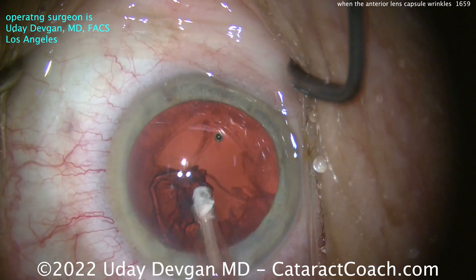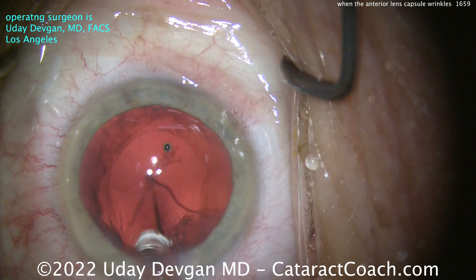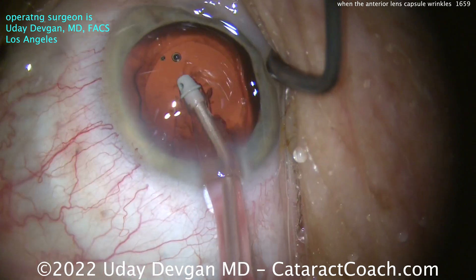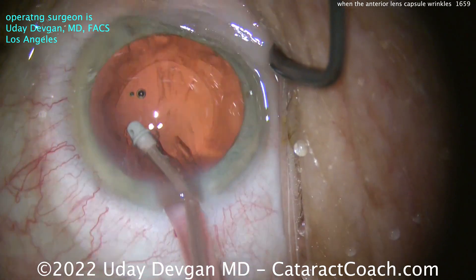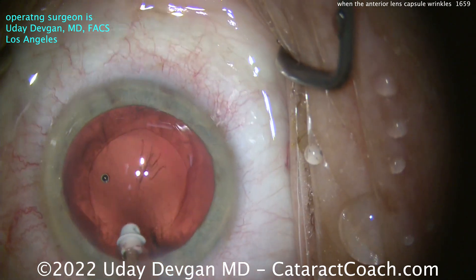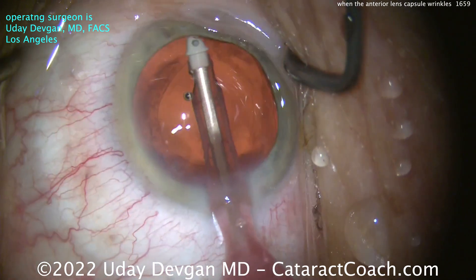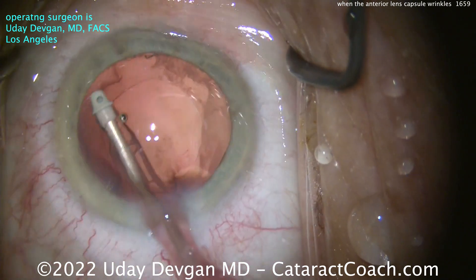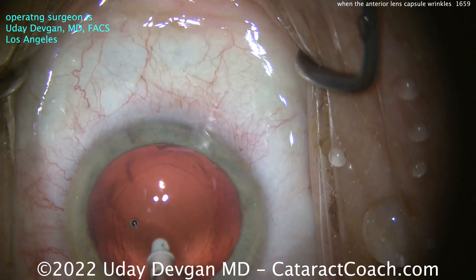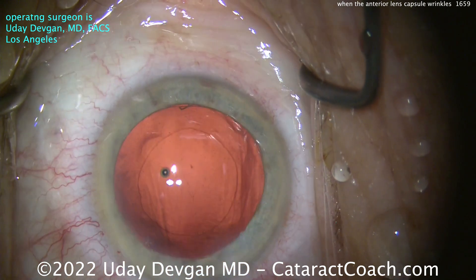The question here is: do you put in a capsule tension ring? There was some zonular laxity at the beginning, and you could put one in — but I don't think you have to. Surgeon judgment here. In my call for this patient, I decided not to put in the capsule tension ring. So we clean up the capsule bag very nicely. Good support — enough that it's really maintaining a nice-looking rhexis. I'm doing a little capsule polishing, because if it is weak zonular support, I don't want to leave fibrosis in the future.